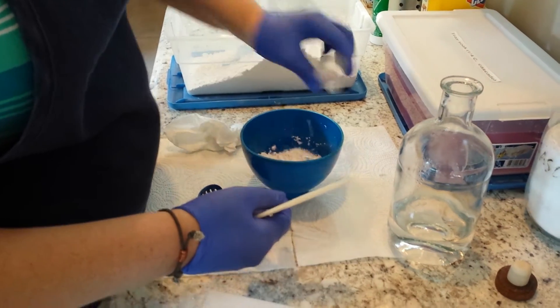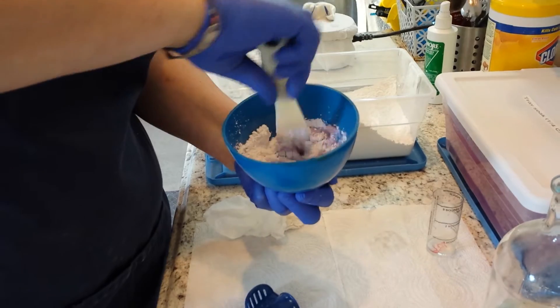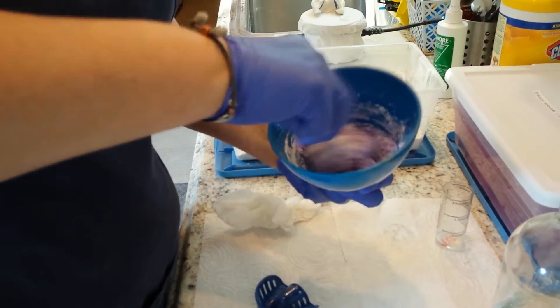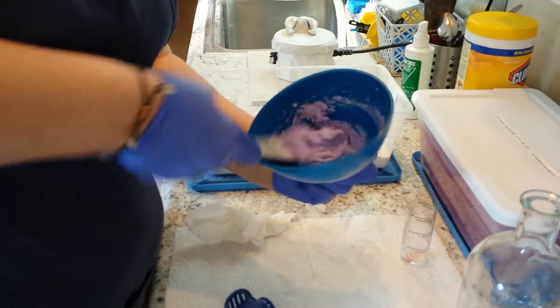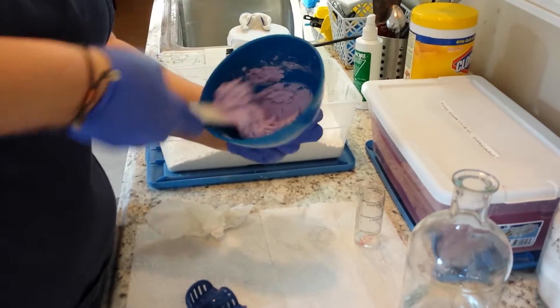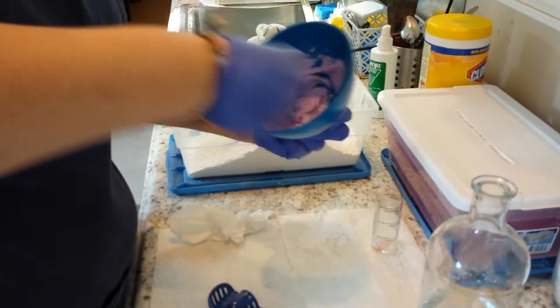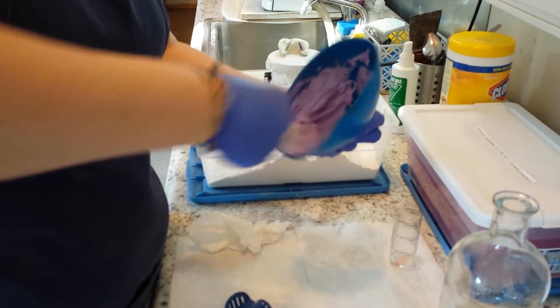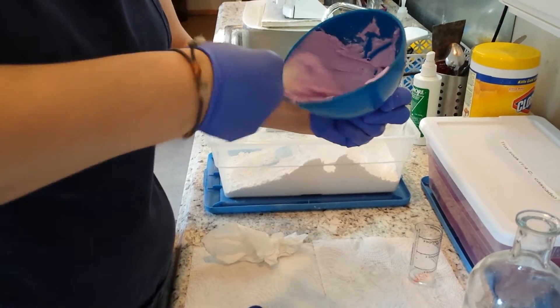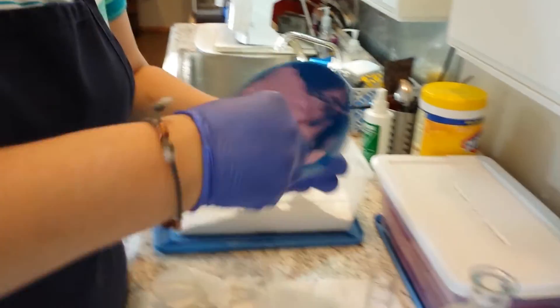Go ahead and pour all of that in and mix it really well. We want to make sure that you incorporate all of the powder. Sometimes impressions come in very grainy, and that is a result of not mixing all of the powder into the liquid. You need to mix it until it's very, very smooth — you can see how nice and smooth that is. That's how it needs to be.